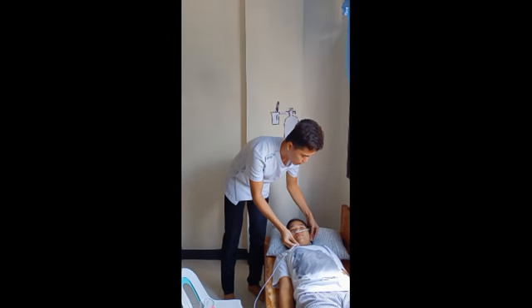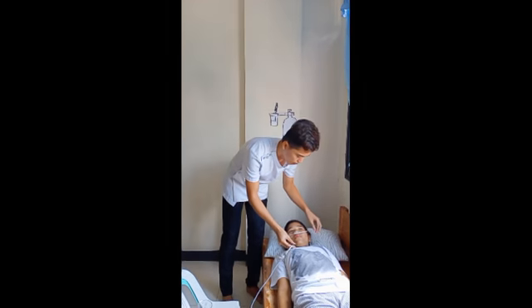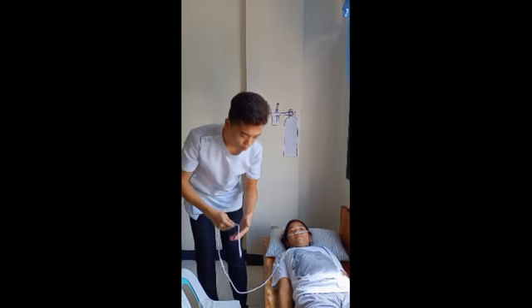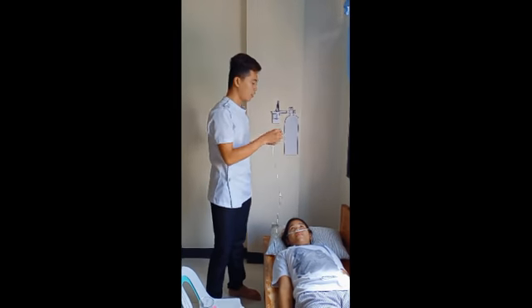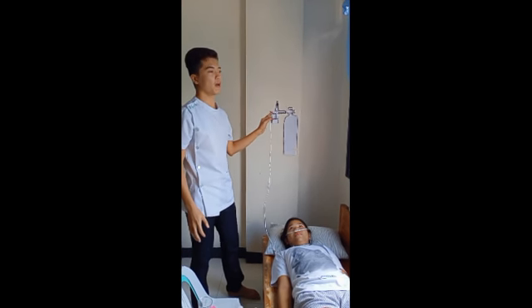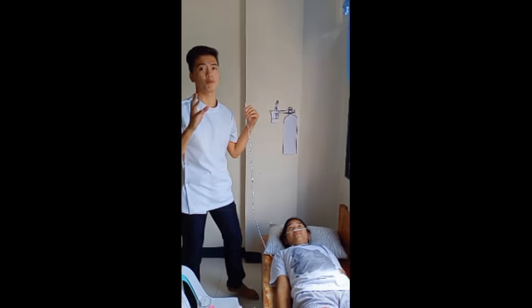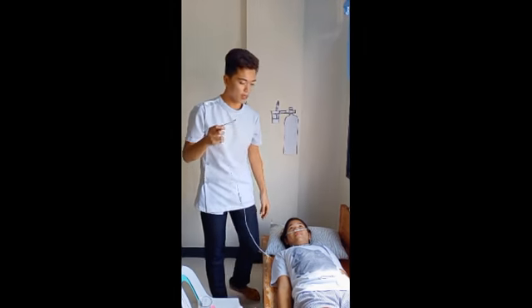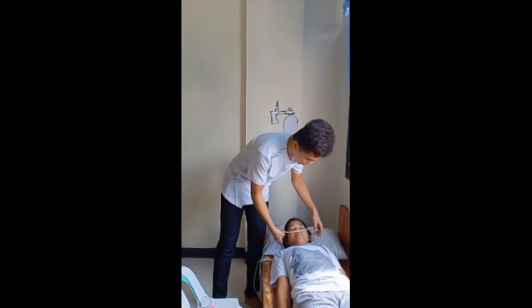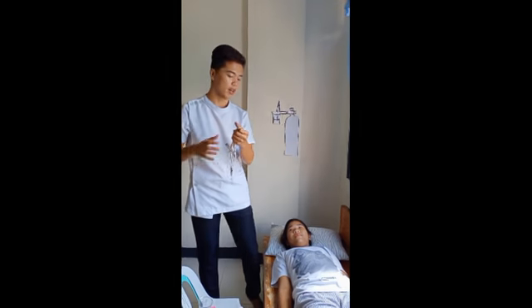If needed, just like this. So this one you need to put here in the humidifier bottle. Just like this. Let's assume that I put it here. The next is, I'm going to discard this one because I'm done with the nasal cannula.